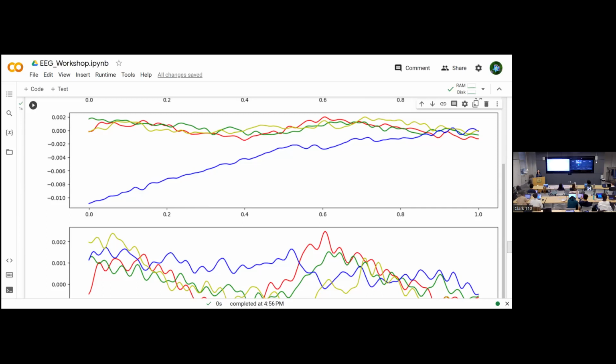For example, the subject saw a card and missed that it was their card and remembered it later, but didn't have a timely reaction. So you'd be visualizing the EEG data for all those 100 segments and also the segments for each card. That's 4 different categories. Usually, professionally, you would go through each of those segments, pick out any outliers, and delete them when you're considering the averaging inside each category.